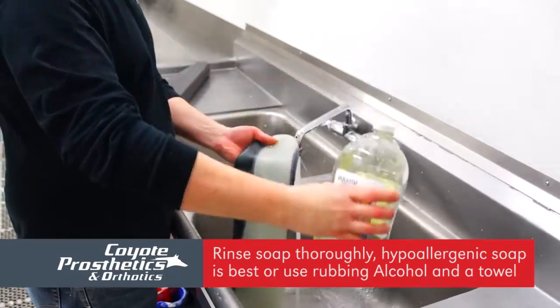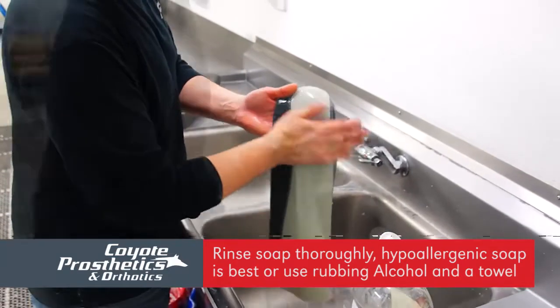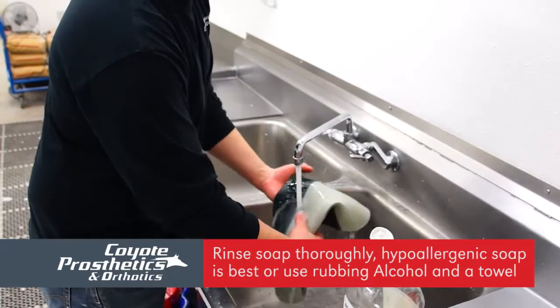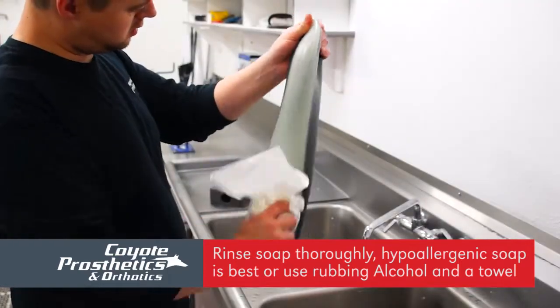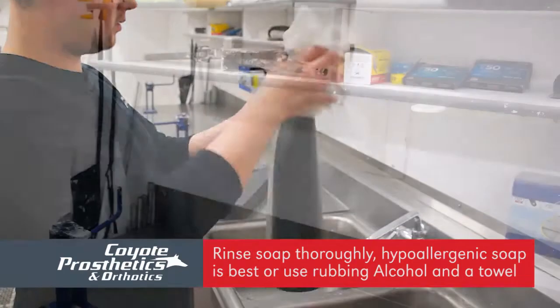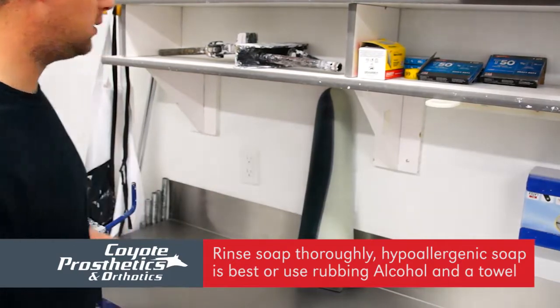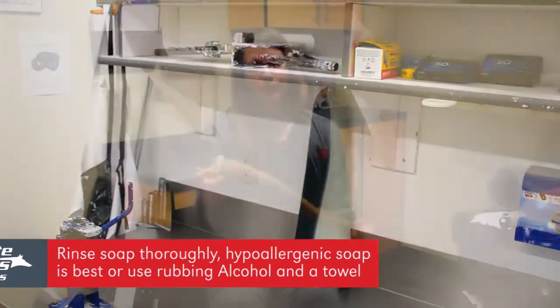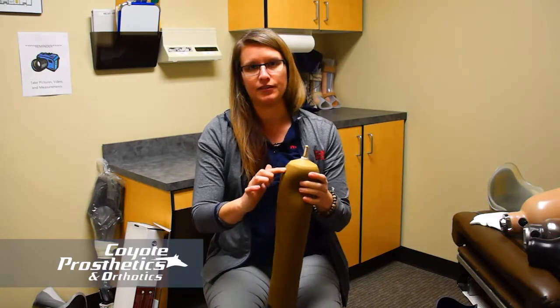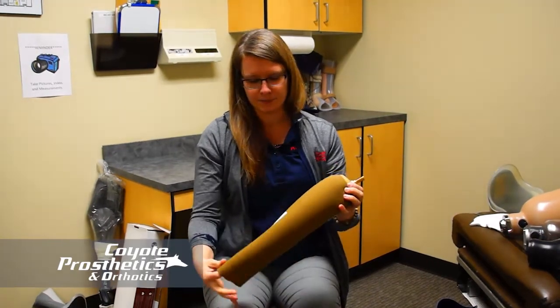When you're done, you can kind of dab it dry, but you want to make sure you're not using a fuzzy towel or something, because this is a really sticky material and all those little fuzzy pieces will stick to it. If you want to let it air dry, that's fine too, but after you wash it, make sure that you always turn it back so that it's right side in. If you leave it inside out, that can kind of cause degradation of the material down here, and it'll just wear out your liners faster.